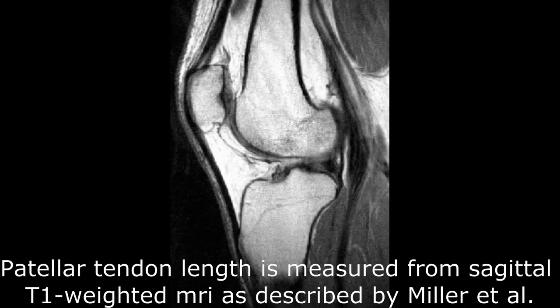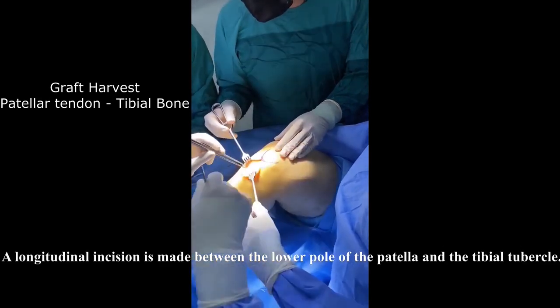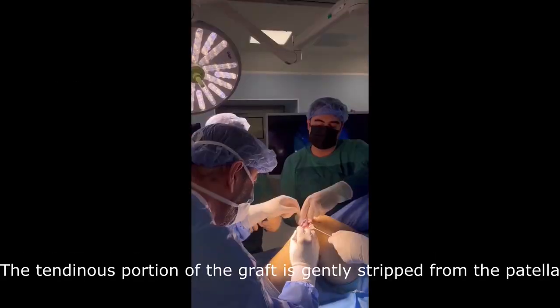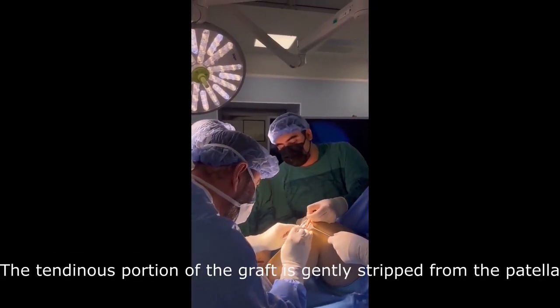Patellar tendon length is measured as described by Miller et al. A longitudinal incision is made between the lower pole of the patella and the tibial tubercle. The tendinous portion of the graft is gently stripped from the patella.